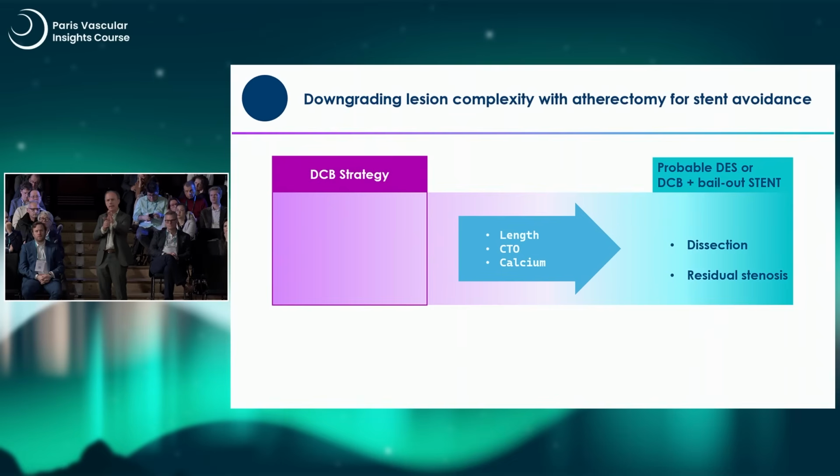You mentioned a few times, I'm afraid that I will miss some wall apposition, which is of course extremely important, and cardiologists know this better than vascular surgeons, how important it is. But is this the only reason you want to avoid stenting with this fantastic one-year data that Caroline showed, or are there other reasons to avoid stenting here?